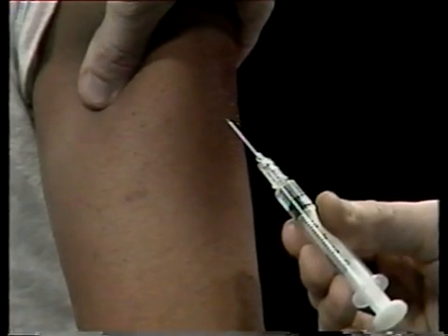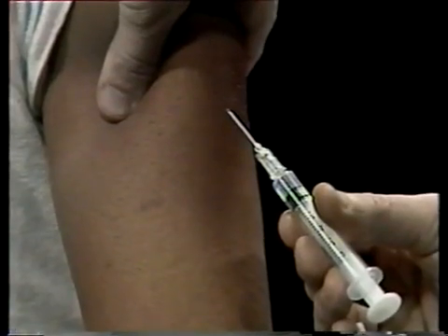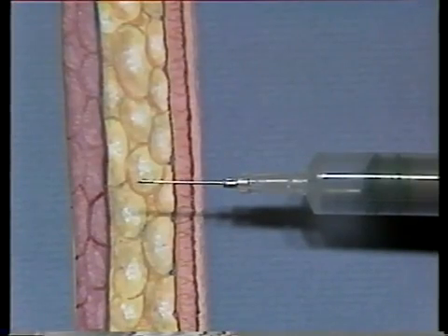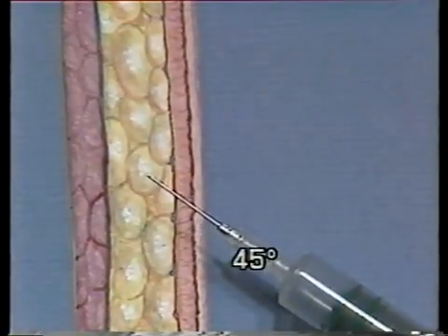Now move the needle up toward the cushion of skin you're pinching between your fingers. Hold the needle at about a 45 degree angle upwards. Straight in is 90 degrees; 45 degrees is halfway.